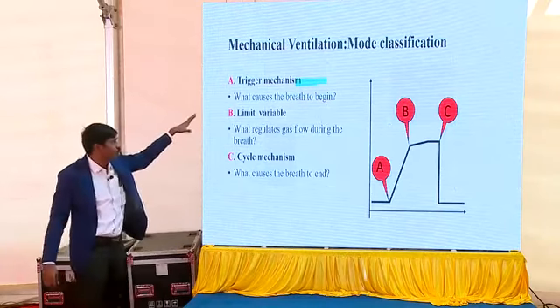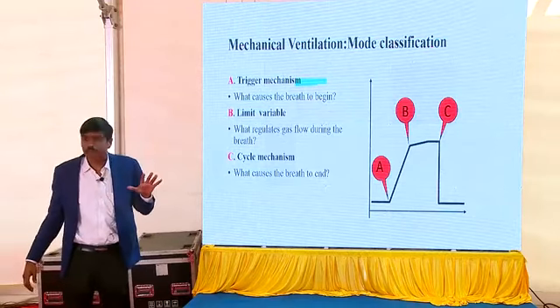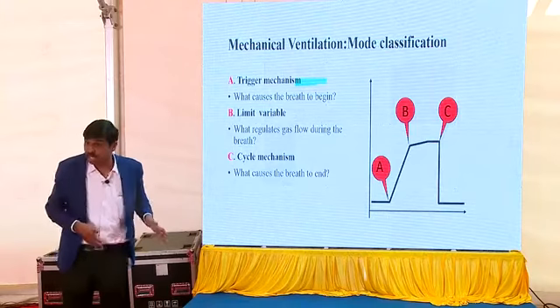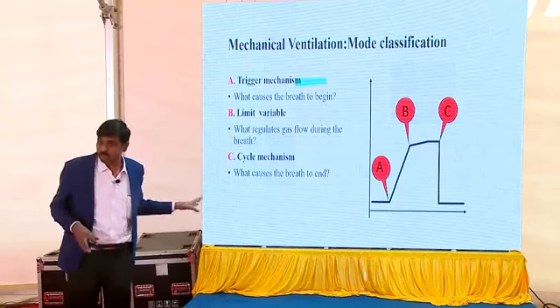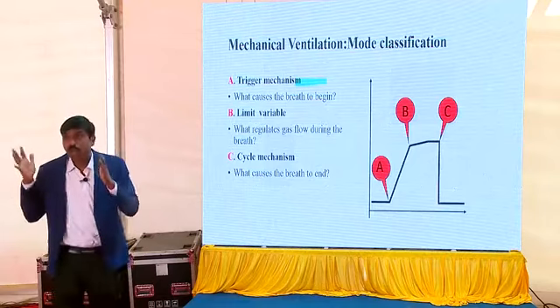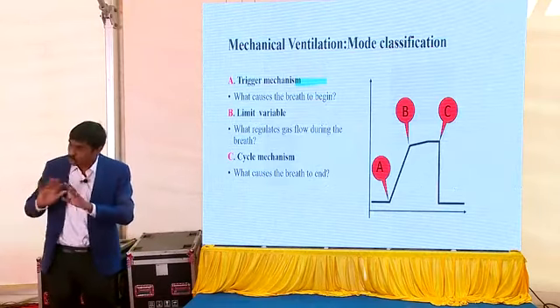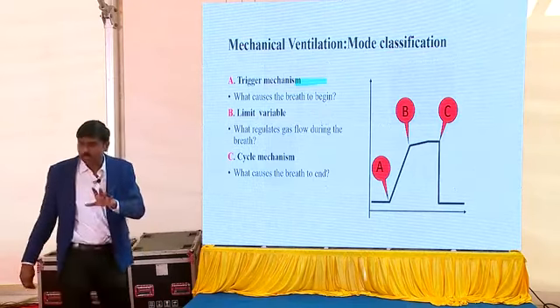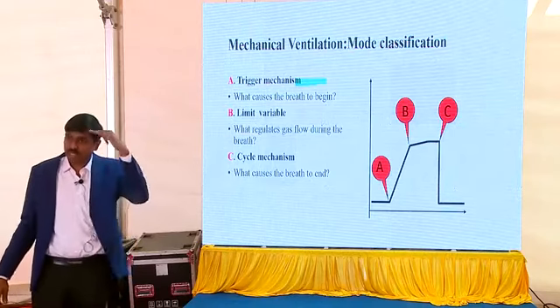Now coming to which mode we select. Many of us use different ventilators, and there are many terminologies there. All the alphabets are put into something and they tell you that this is the mode we got. The crux of it is you should be comfortable with the mode you have in your ventilator, but you should know how it works, because all of them ultimately have the basic fundamentals. In the modes, there are 3 parameters you will have to see. All modes have these 3 parameters.